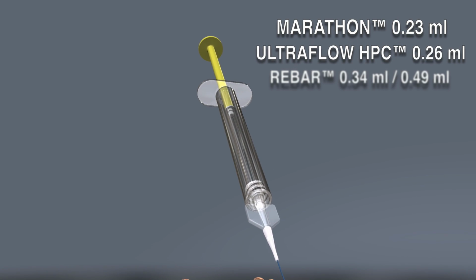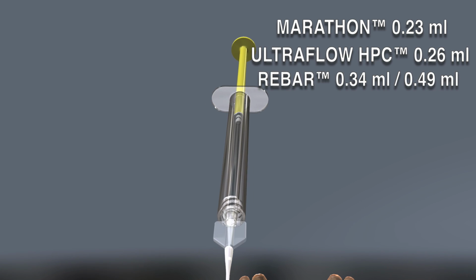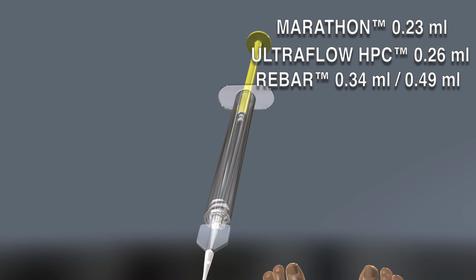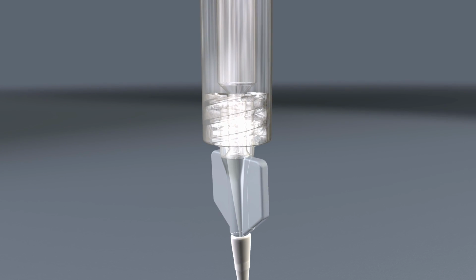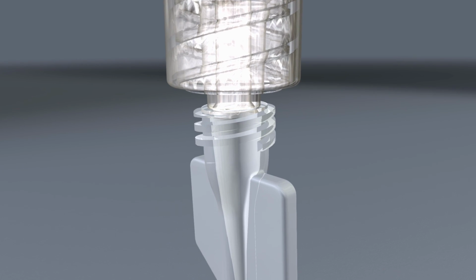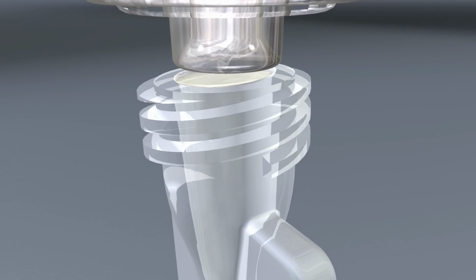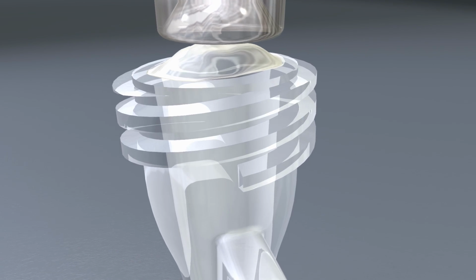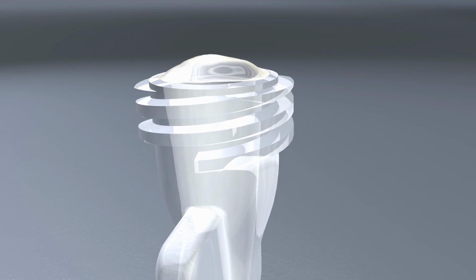The catheter dead space is called out on the catheter package, and in the case of the Marathon flow directed catheter, the dead space is 0.23 milliliters. As soon as the DMSO has been injected into the catheter dead space, remove the DMSO syringe. Hold the catheter hub in a vertical position and overfill and wash the luer hub with the balance of the DMSO, creating a meniscus of DMSO in the catheter hub.